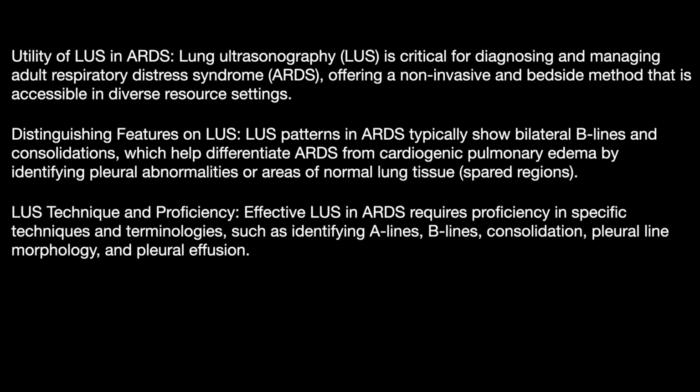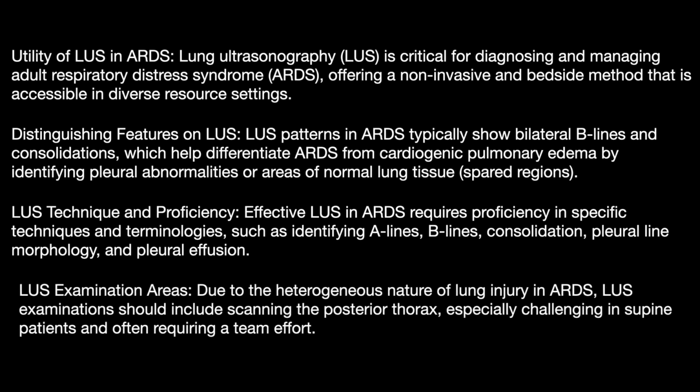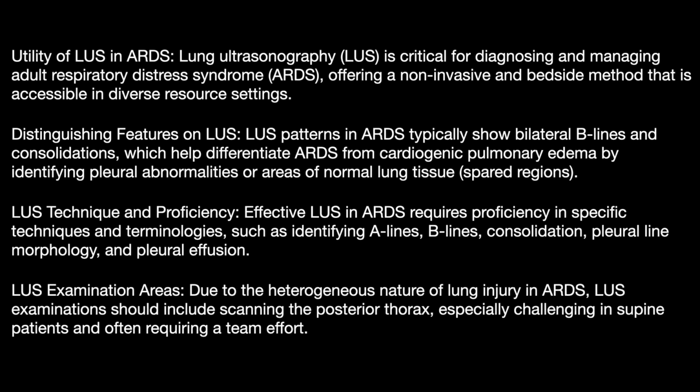Now, the technique and proficiency. Lung ultrasound in ARDS requires proficiency in specific techniques and terminologies, such as identifying the A lines, B lines, consolidation, pleural line morphology, and the pleural effusion. Due to the heterogeneous nature of the lung injury in ARDS, lung ultrasound examination should include scanning the posterior thorax as well, especially challenging in supine patients and often requiring a team effort.